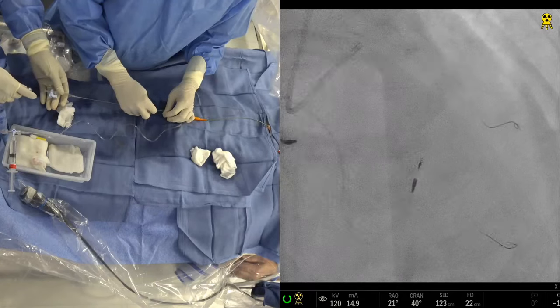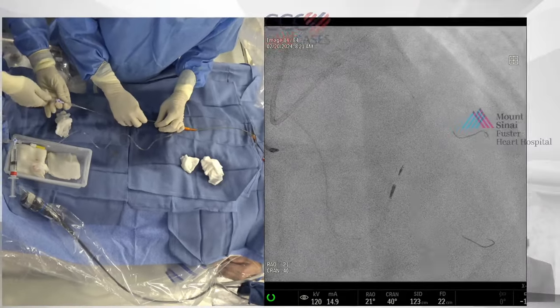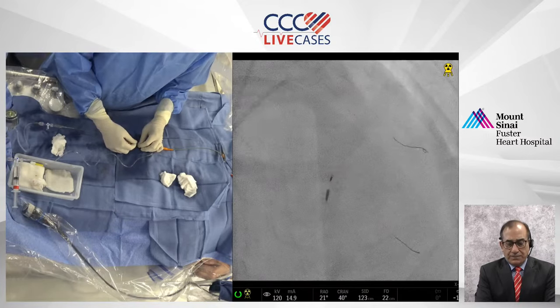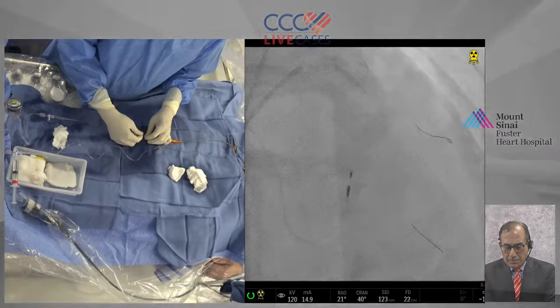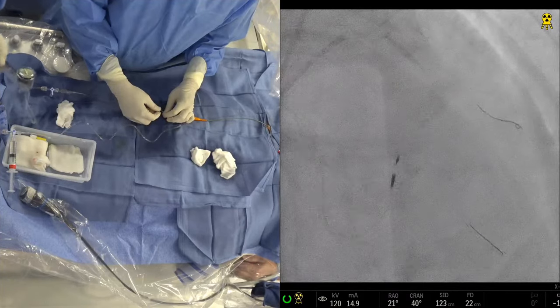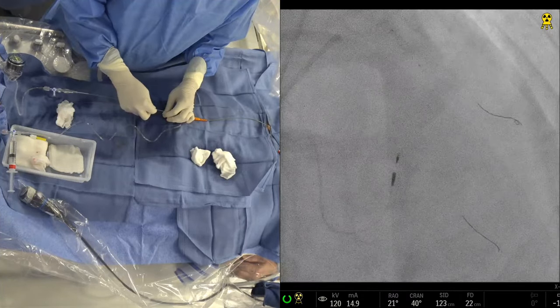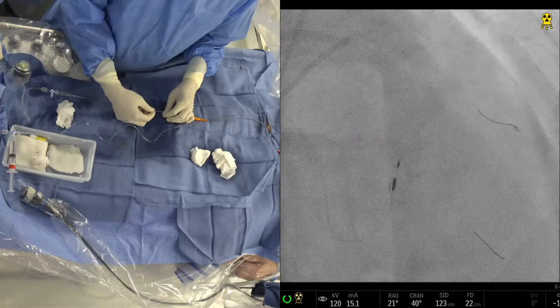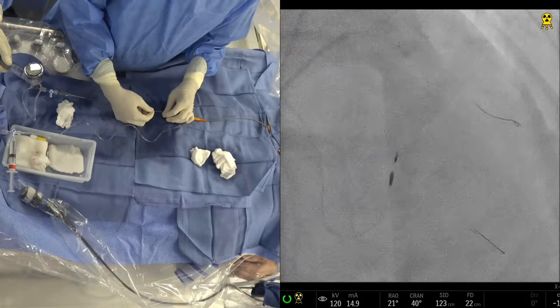Wonderful strategy. And for the benefit of the audience, we have an excellent teaching case. Yeah. And definitely, if you take the tightest lesion down, 90% was in the proximal RCA, just a focal lesion. Mid was about 70, there was a little normal gap. So we put two stents in the right coronary.